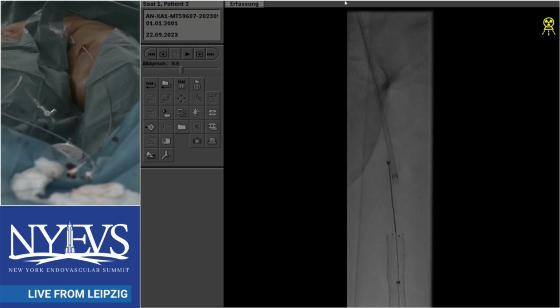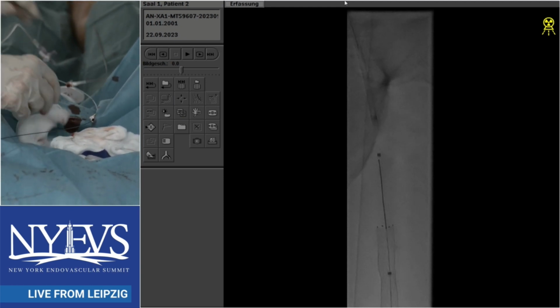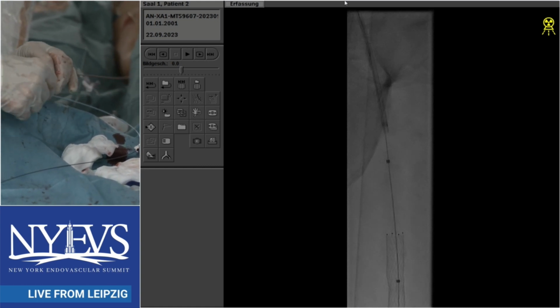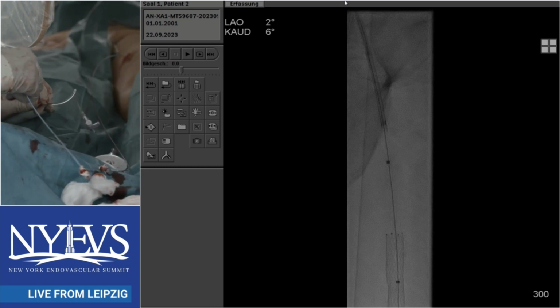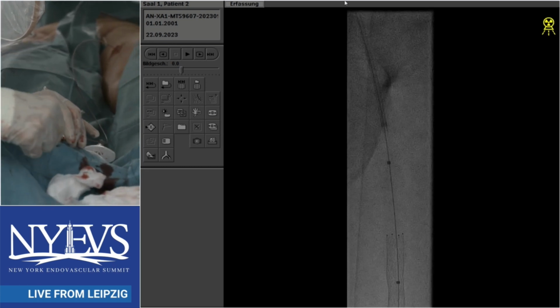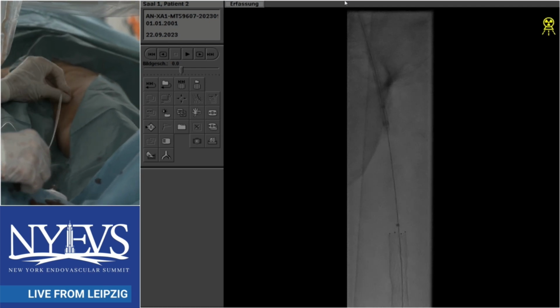Right. So the concern I always have, which the limited studies show, is not a whole lot of DVT risk from it. It's a very low percentage, but do you want to risk that on top of everything else in the claudicant? I agree with Christian. Everyone's not as fit as Christian, so you have to think about this patient. And you also need, I think, 2 centimeters proximally in the SFA as well.